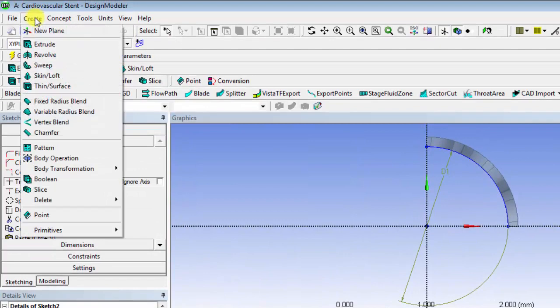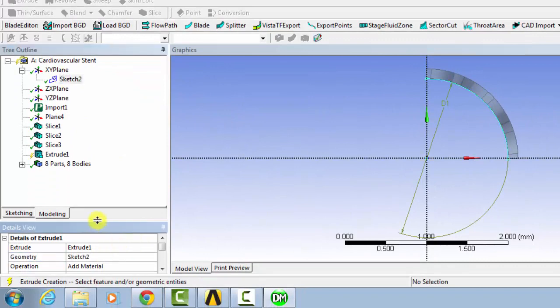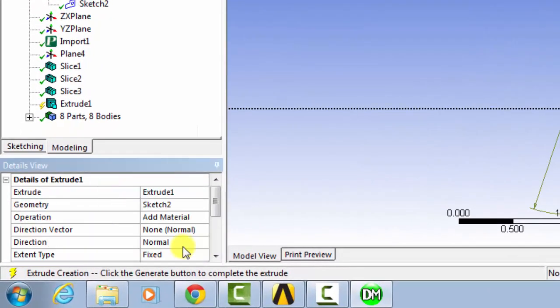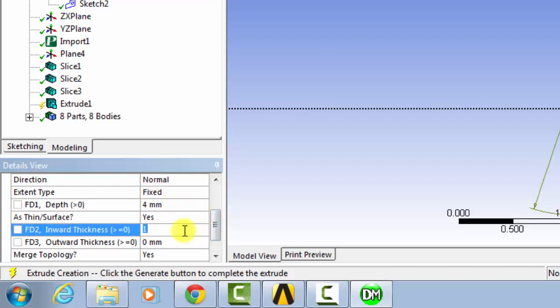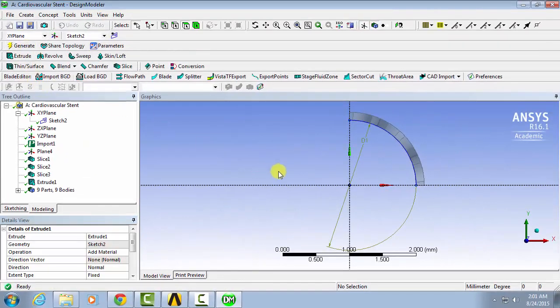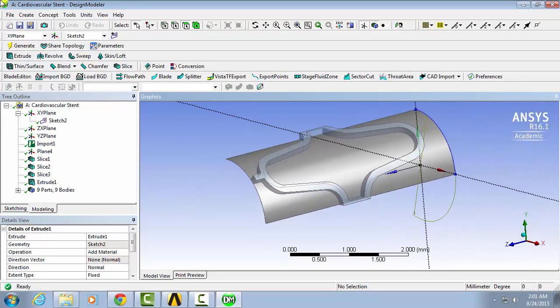And then we can go to Create and Extrude and select the sketch. And under as thin surface, select Yes. And then we'll have FD1 will be 4 millimeters. So it'll go 4 millimeters from the XY plane, and we'll make its inward thickness 0.001 millimeters. And then we click generate. And you'll see that we've created the model for the balloon right inside the stent.